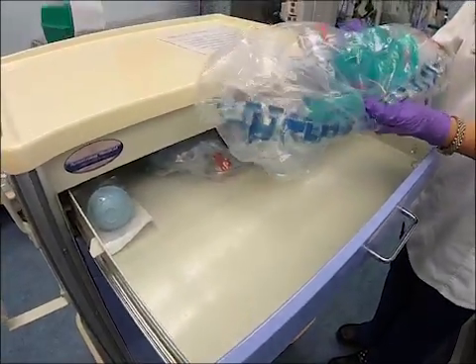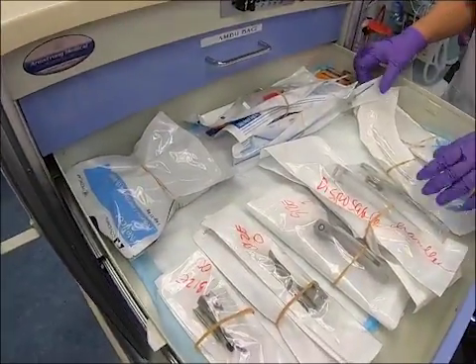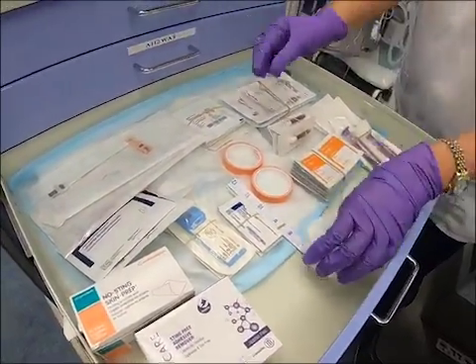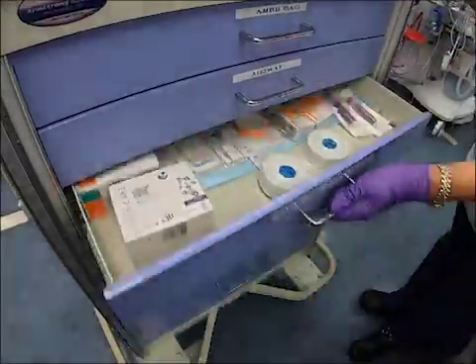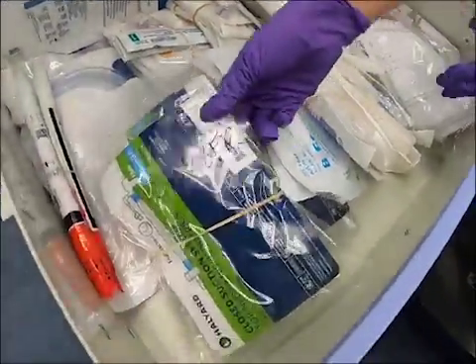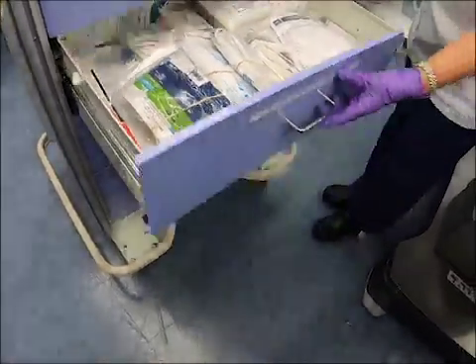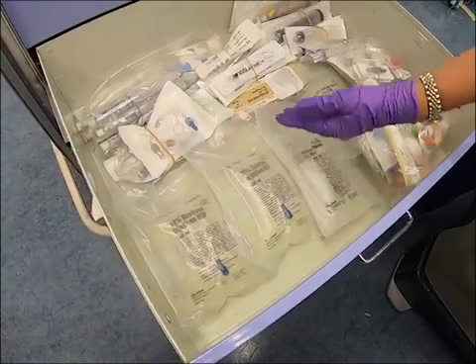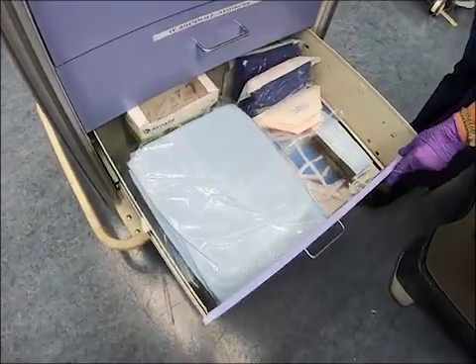The NICU CV19 cart consists of: the bag mask filter valve device, which was preassembled by the respiratory therapist; intubation supplies; miscellaneous items such as adhesive tape; and monitoring supplies such as electrodes and pulse oximetry probes. We also have the umbilical catheter insertion tray, suctioning supplies, and supplies for emergency chest tube insertion. Emergency medications, fluids, and flushes are also stored here, as well as a personal protective equipment drawer.